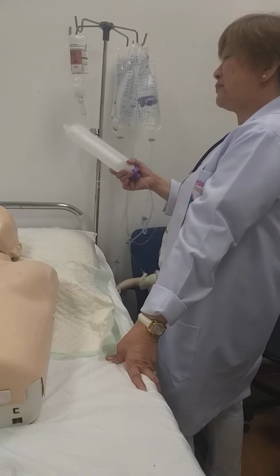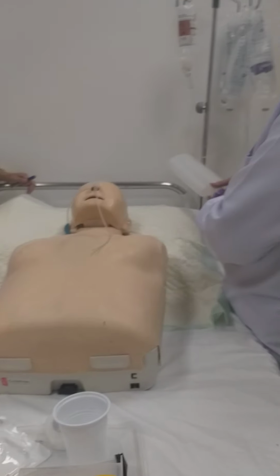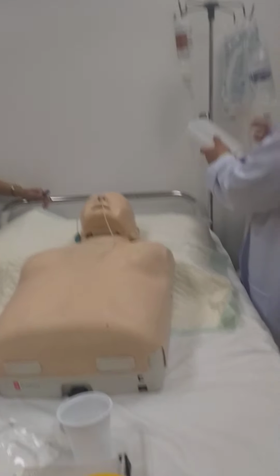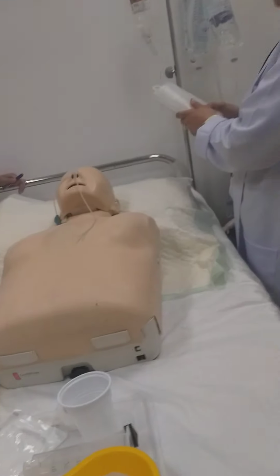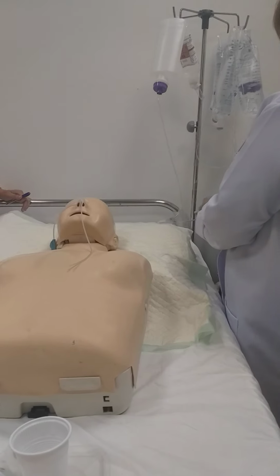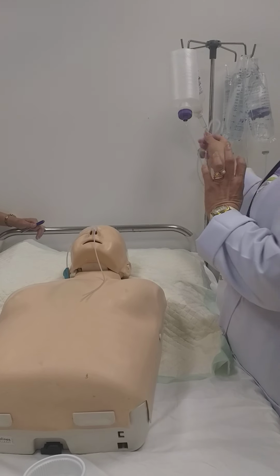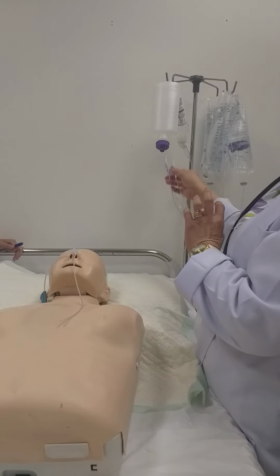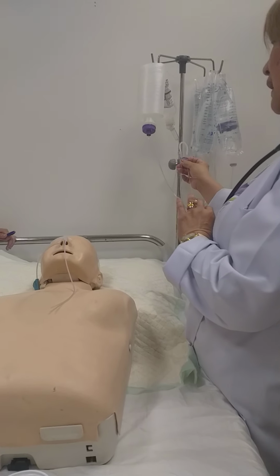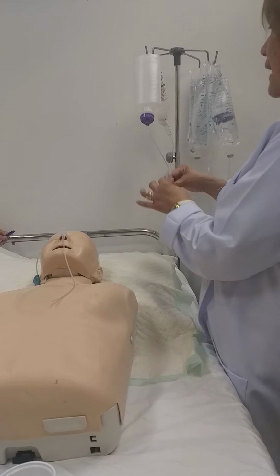Okay, before the feeding, at least 10 minutes, keep it out. Get a towel, and just keep it on the bedside before you feed it. So hook it. Either you will attach it in the machine. There is a machine for feeding. So what you can do is attach this and set it.